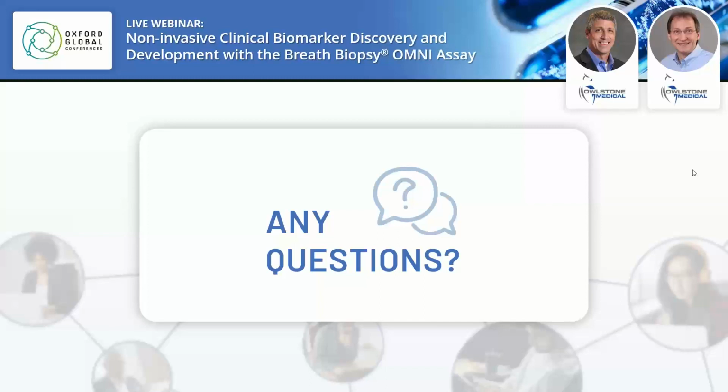Sure, so I'll take that one. Certainly diet will have an impact on some of the markers, just like any other clinical test that's being done, whether it's measurement of biomolecules in plasma, urine, or other biofluids. Now, we're not aware of any really high quality, rigorous studies that have looked at various diets on the different markers, but we can anticipate there would be some. We also have knowledge of what some of these markers are and where they're derived from, and so we do have that knowledge going into some of these studies.